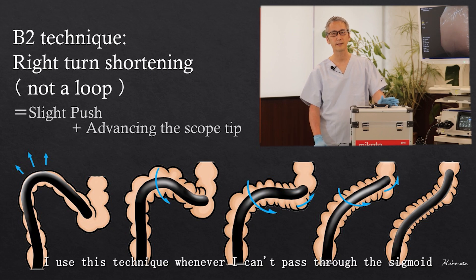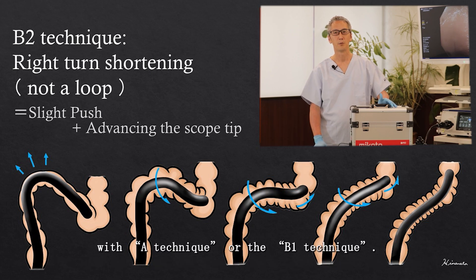I use this technique whenever I can't pass through the sigmoid with A technique or the B1 technique.